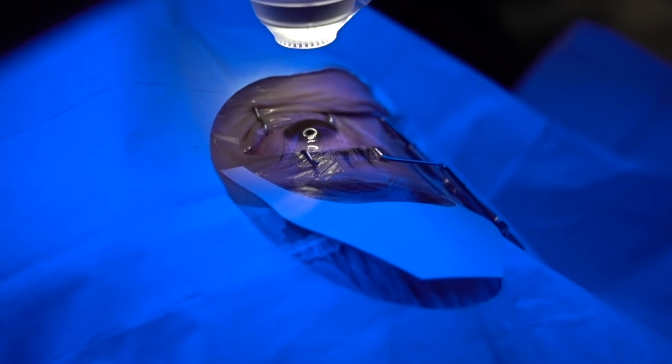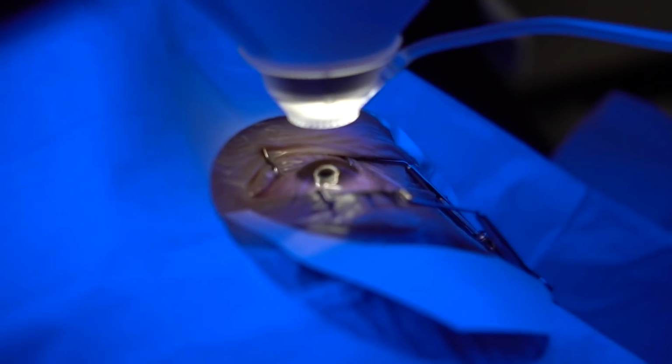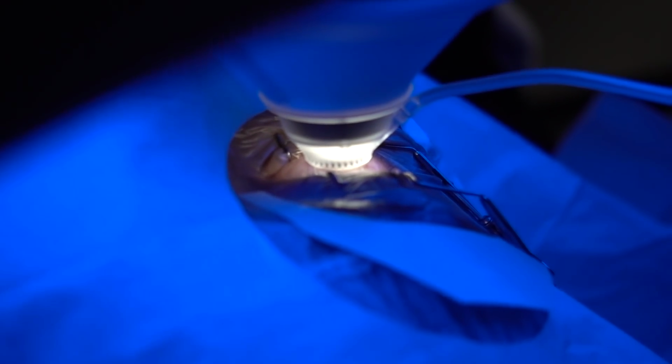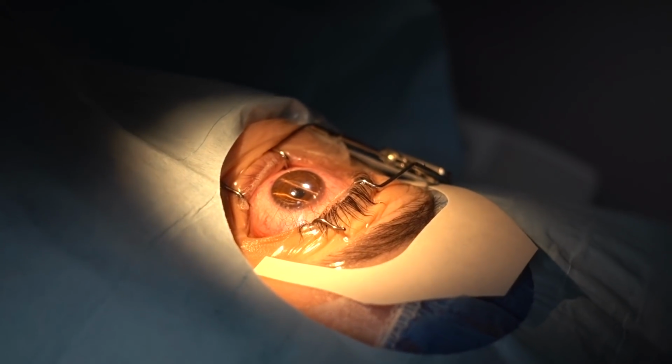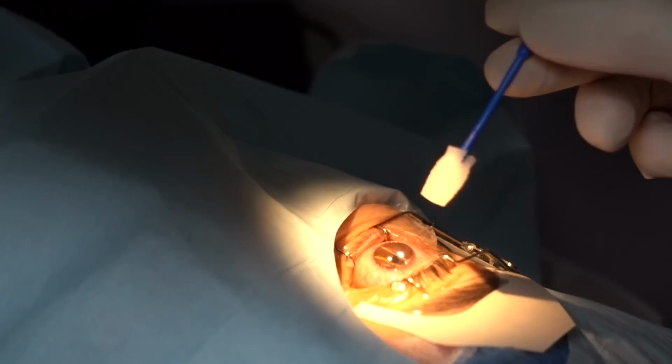Chin up just slightly. Good. You're looking right at the light, Joycelyn? Mm-hmm. There are two lights. One is a blinking green light. You see it? Yeah. And there's also a red light.